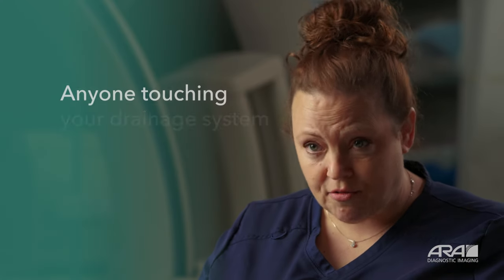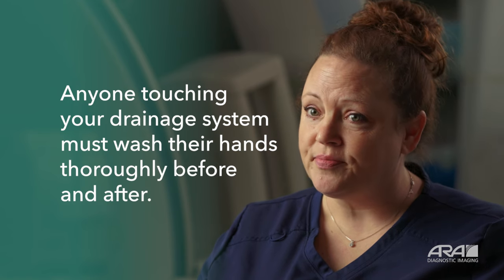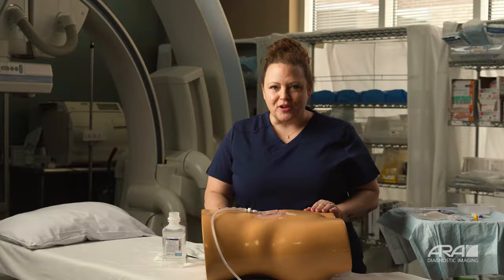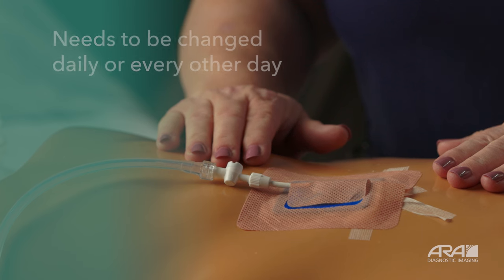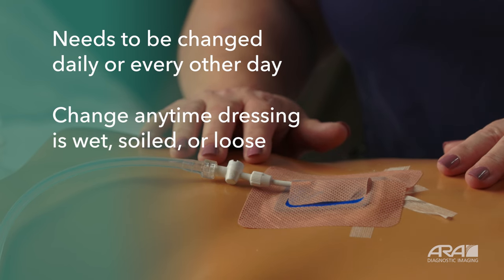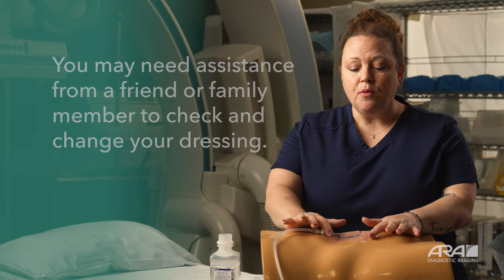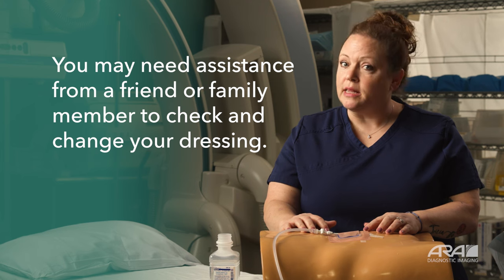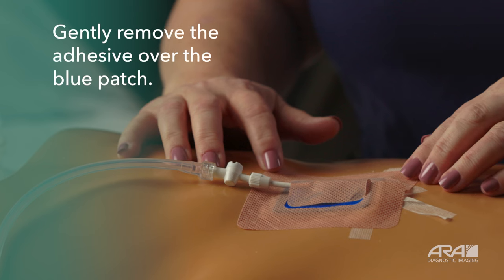When you come home from the hospital or clinic, make sure to wash your hands thoroughly. Let's talk about changing your dressing. Your dressing will need to be changed every day or every other day, and it should be changed anytime it is wet, soiled, or loose around the edges. When you come home from the hospital or clinic, you're going to notice your dressing is probably a little different than what you have to work with.